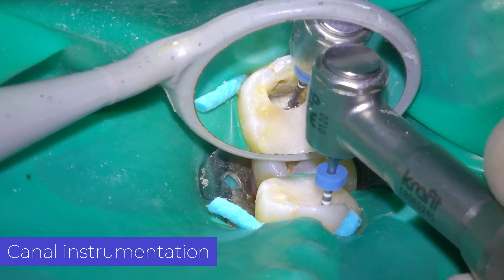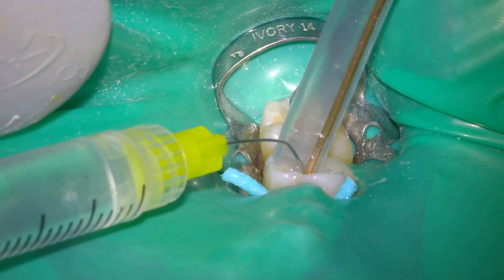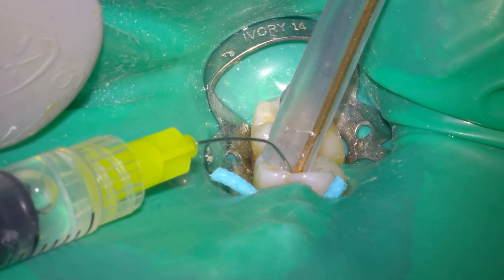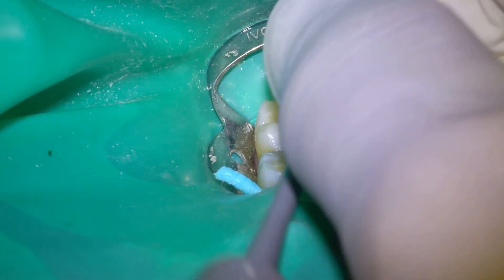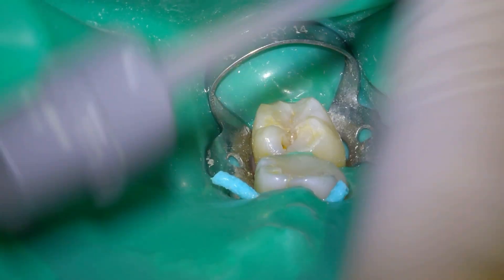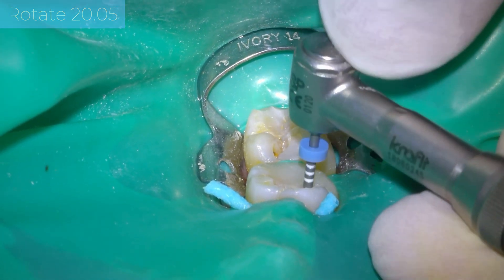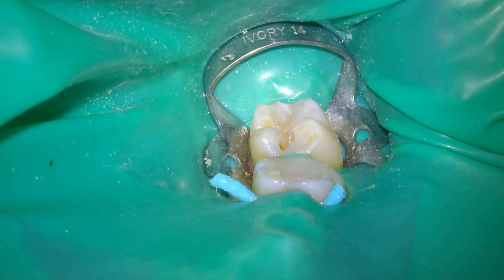Once we have established the working length, we work the root canal in the usual way. I use the retreatment system with brushing movements. You should always try to make this movement towards the safe area of the root canal.